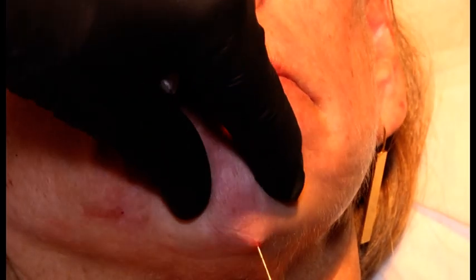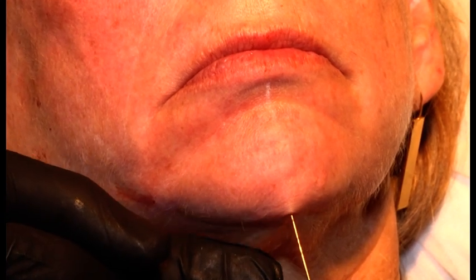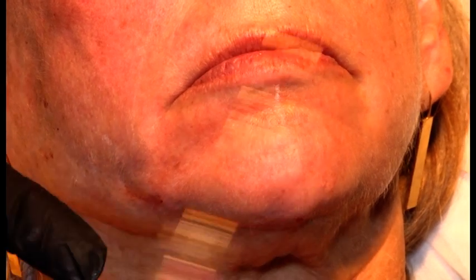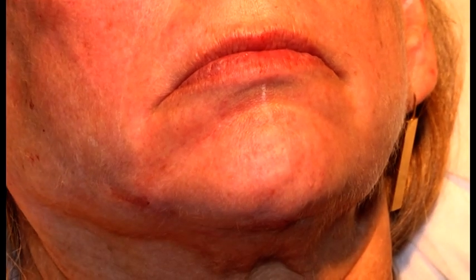little amounts, 0.1, another 0.1, 0.2. All right. And then you get an anterior projection of the menton.